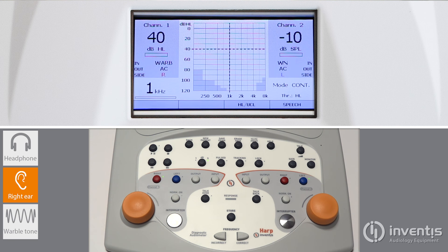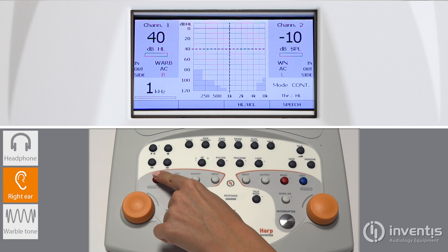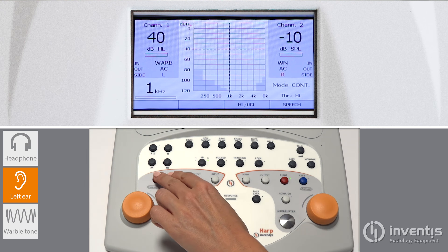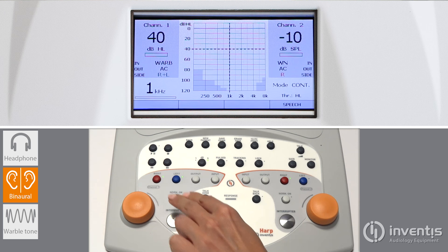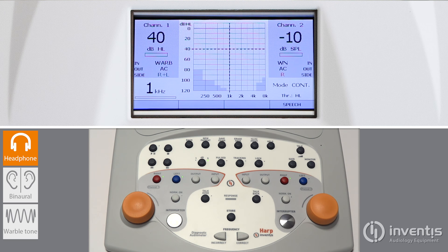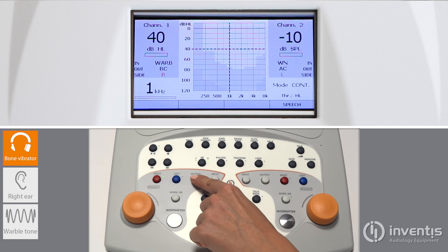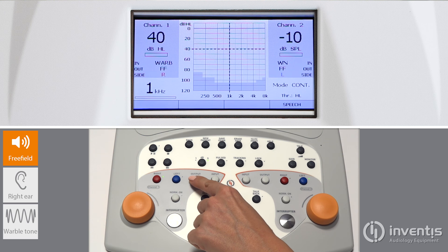Red and blue buttons are relative to the selection of the ear under test — red for right and blue for left. Press both at the same time for running a bilateral test. Transducer selection is done by pressing the output key. Push it to change from air conduction to bone conduction to free field.